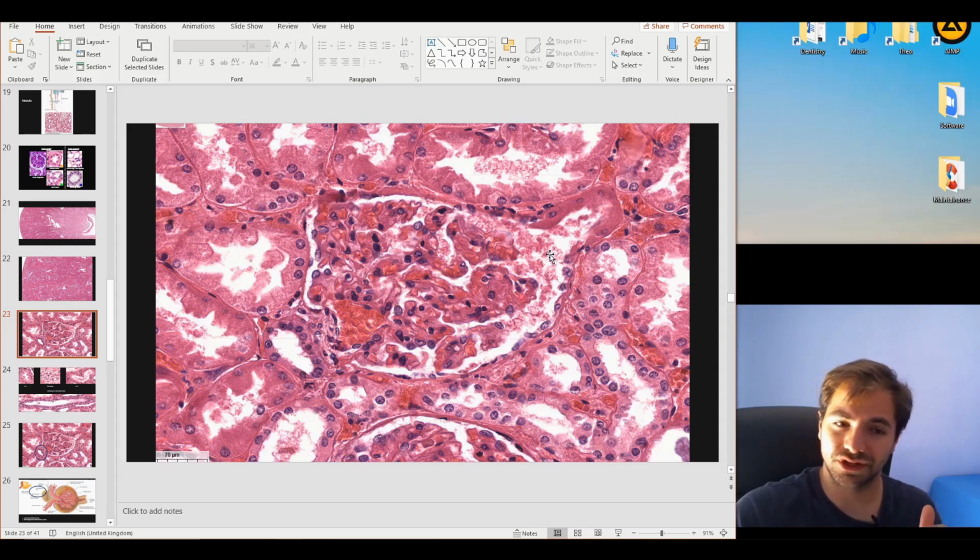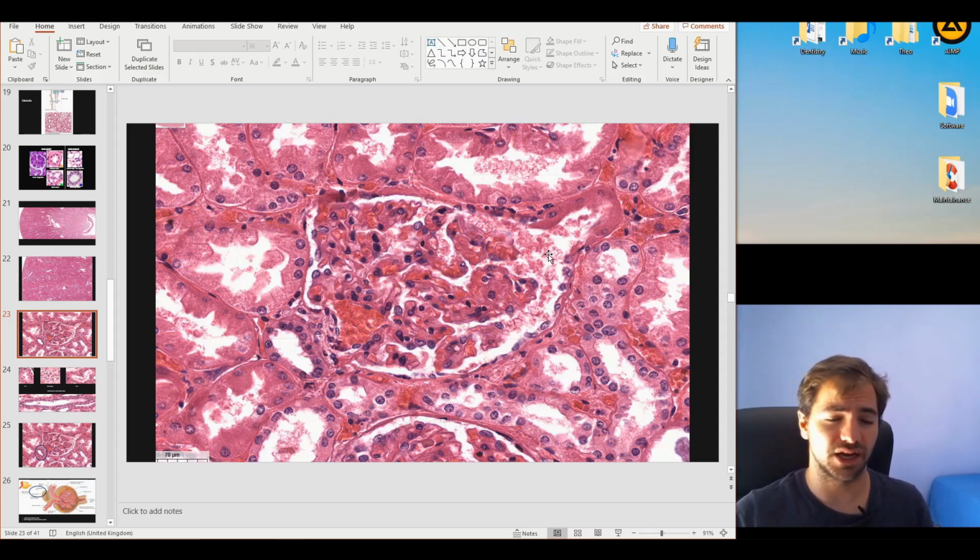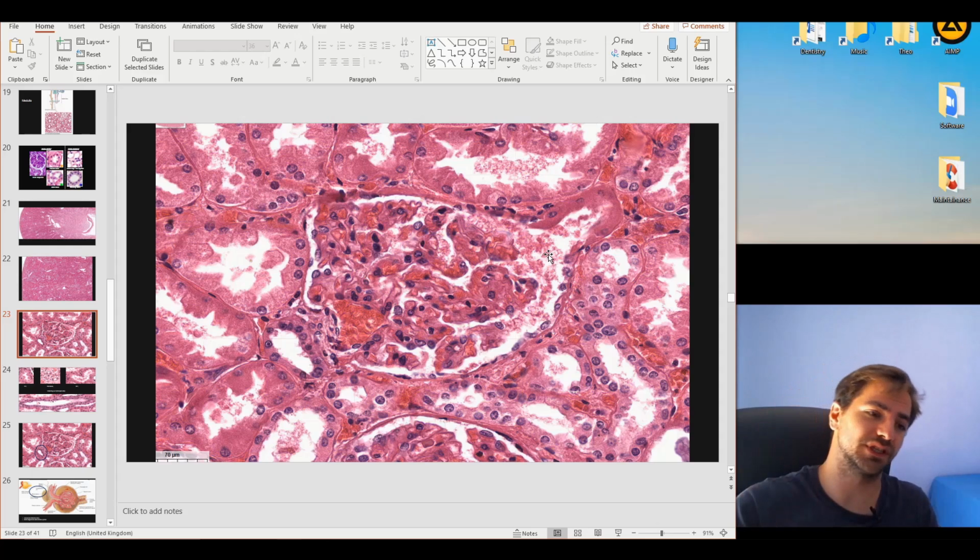Now, I'll be honest with you, it's not easy to identify the specific cells of the podocytes, endothelial, and the mesangial cells, and no one will actually ask you to, and that's not the point of this examination, this presentation. If we're going to find the easy things to identify, of course, it will be the macula densa right here, exactly this very nice part that we're going to see and talk about specifically again later on.